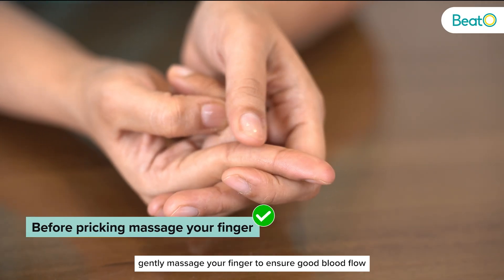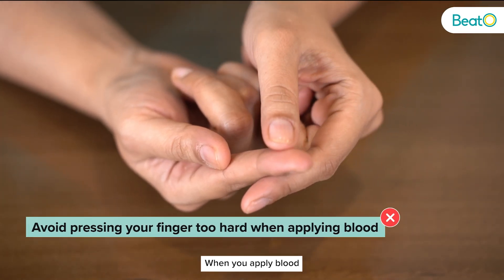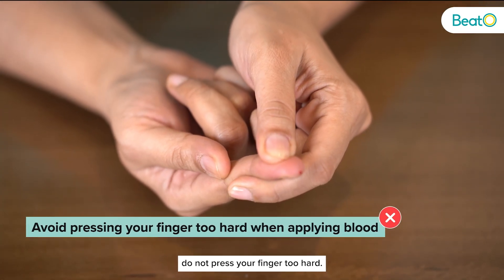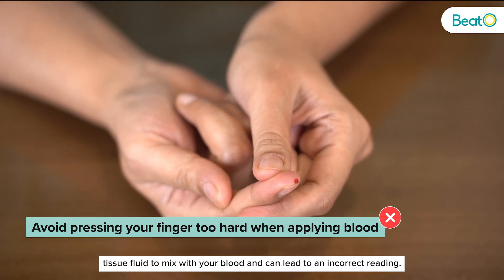Before you prick, gently massage your finger to ensure good blood flow and no air bubbles. When you apply blood, do not press your finger too hard. This can cause tissue fluid to mix with your blood and can lead to an incorrect reading.